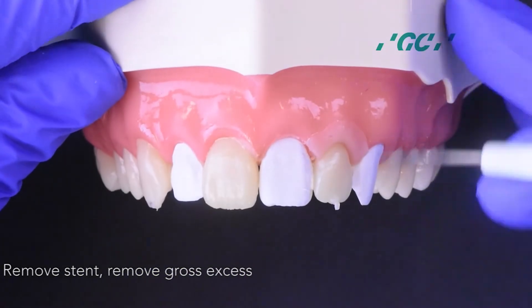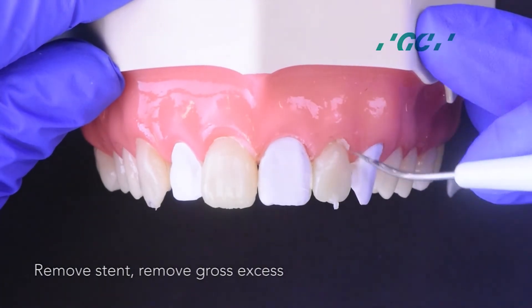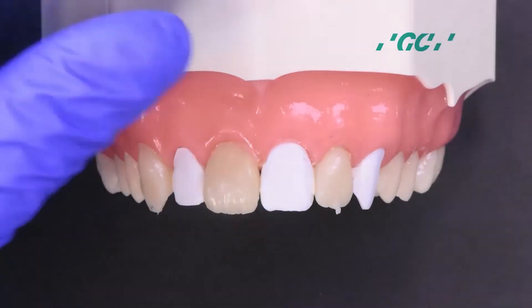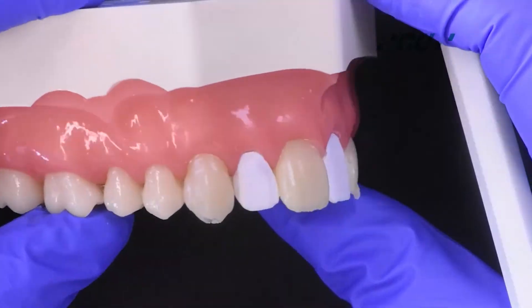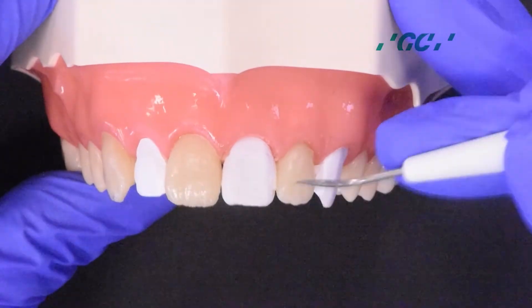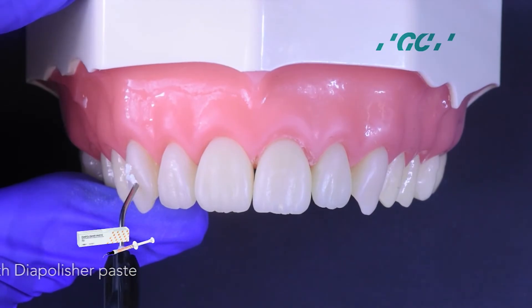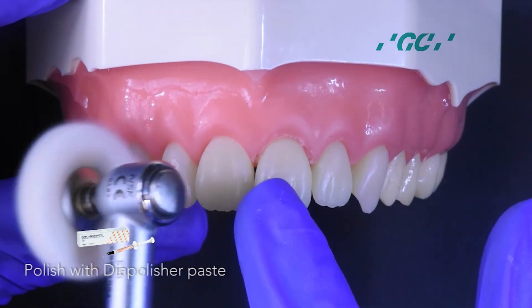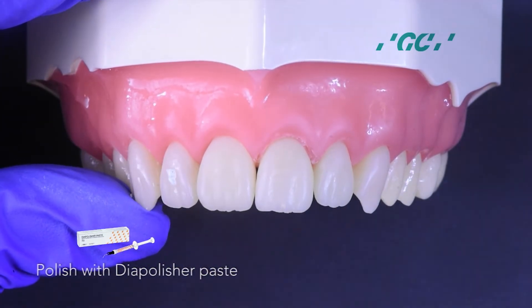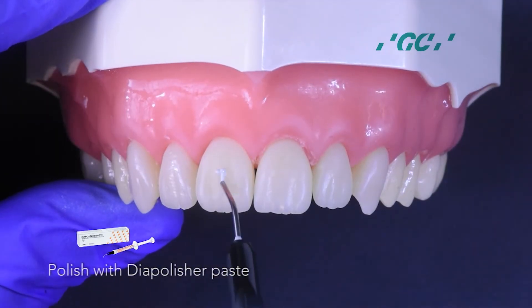Take out the stent and remove the gross excess. Polish with Dye Polisher Paste, a diamond paste containing superfine diamond particles that gives the perfect glossy surface with high luster.